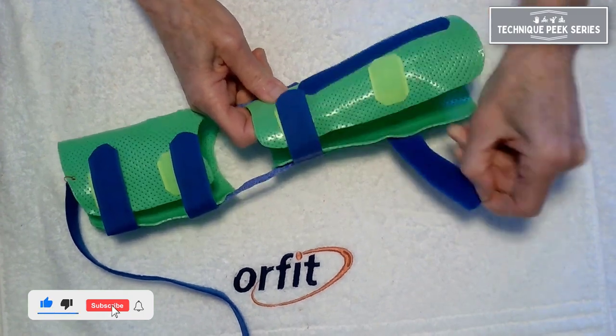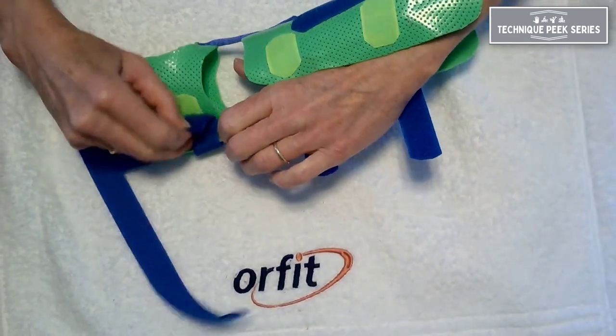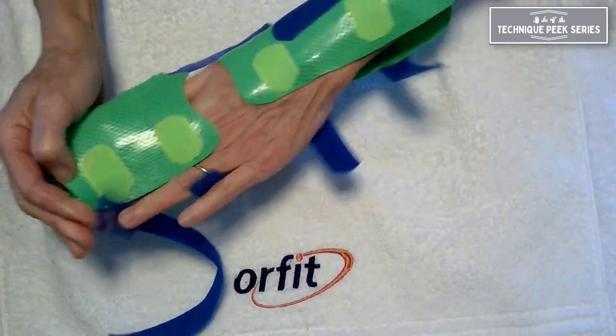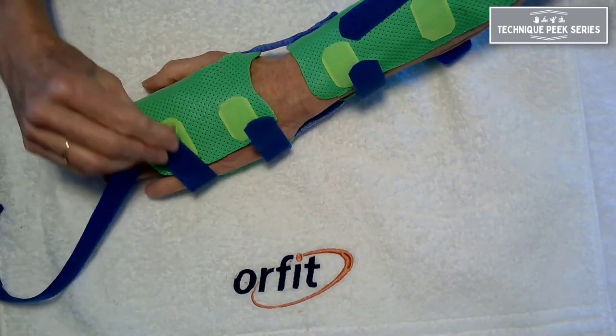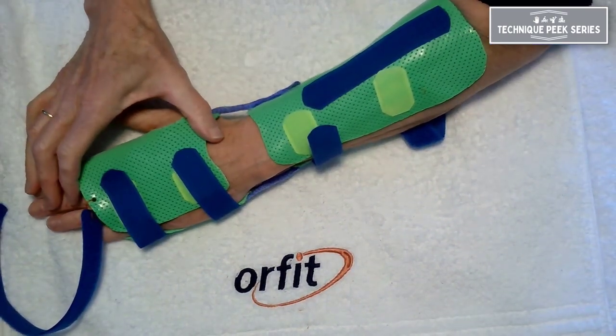First, we fabricate a circumferential forearm and hand-based orthosis. You can make this in one piece and then cut it into two at the wrist joint, which is easy. In this method we have a long lever arm, so I've included the fingers.